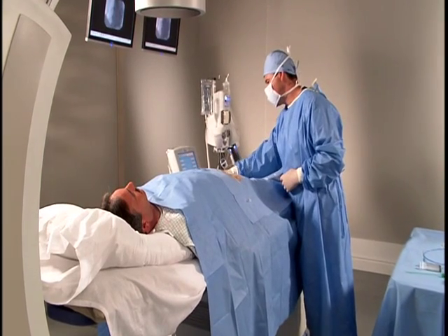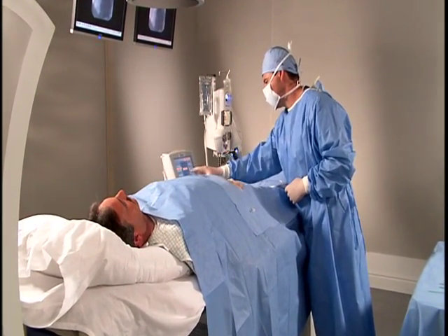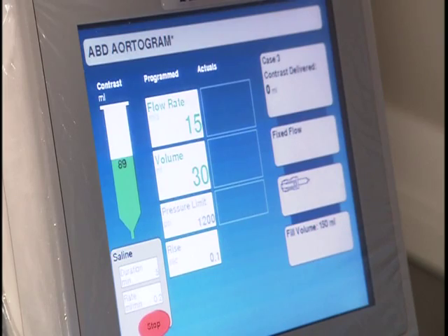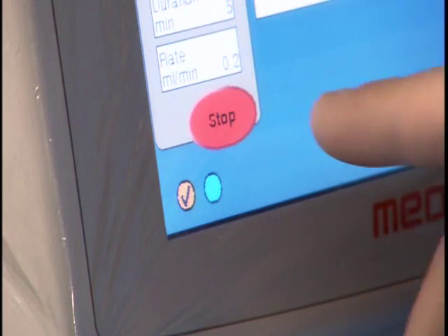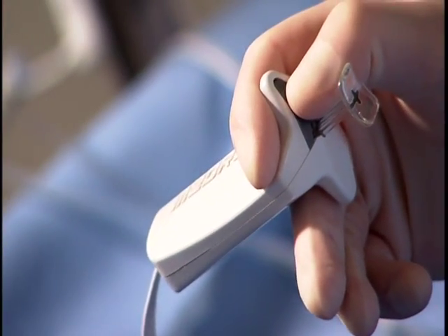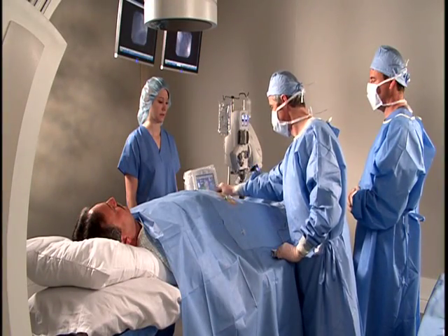ASF is not available when the system is filling the syringe, armed for contrast injection, or when contrast is actively being delivered. The operator can stop ASF at any time by touching Stop on the screen or the hand controller saline button. Note: additional safety features are incorporated into the system.